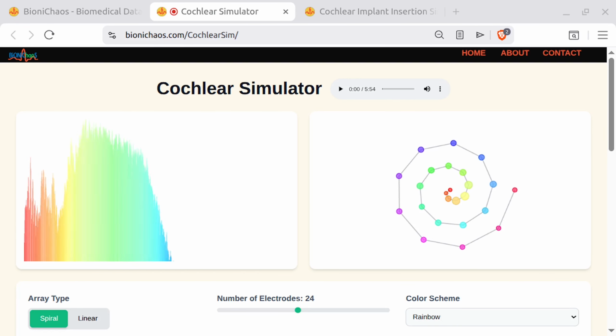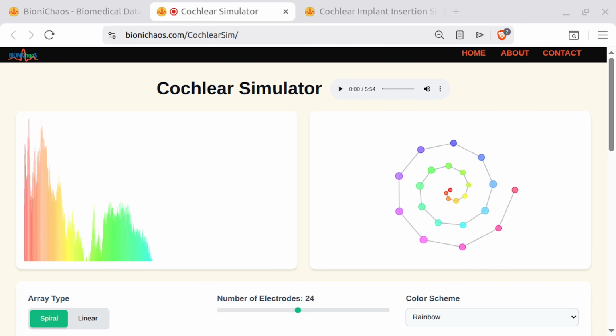Children with cochlear implants, especially those with pre-existing anatomic abnormalities in their inner ear, have a statistically higher risk of contracting pneumococcal meningitis. Because, well, we are creating a pathway into the inner ear. A literal hole in the skull. Basically, yes. But we don't just cross our fingers and hope for the best. We manage this with really rigorous protocols.